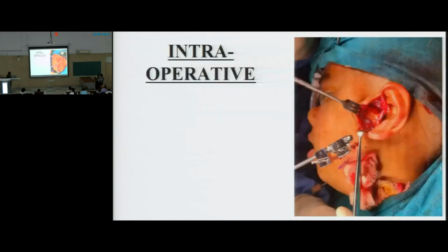And this is the intraoperative picture. If we see, the abdominal graft was also interposed after the condylar mass was resected. The abdominal graft was interposed because the patient should not have any recurrence of ankylosis, and the incision is so small and we can get a very wide exposure as well. And these are the intraoperative pictures. We also place a distractor for the patient, and the ankylosis release was done simultaneously.